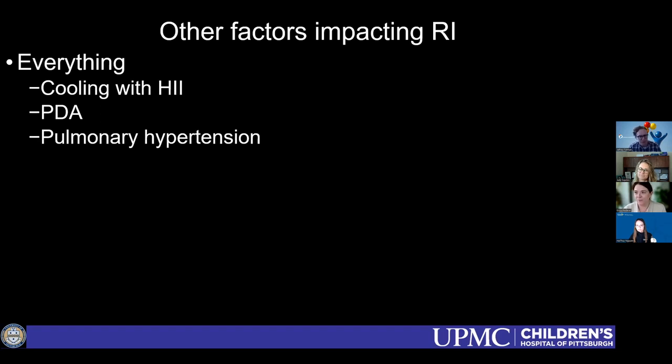Yeah, I know there's also, I think, some work being done at CHOP using microvascular imaging to look at brain perfusion to see if that could be a marker of who's going to respond to shunting. So I think that's going to be really interesting to see get fleshed out. I think it's a similar concept to using those ACA compression images, but maybe a little bit more consistent. I think it'll be interesting for sure to see what comes out of that.